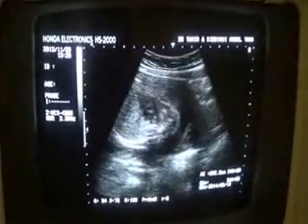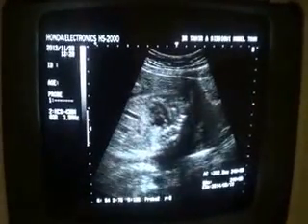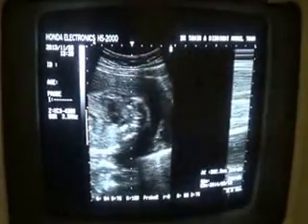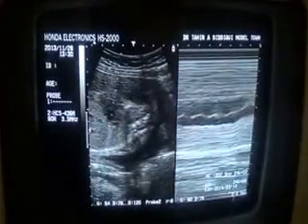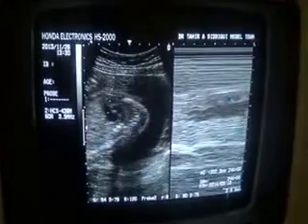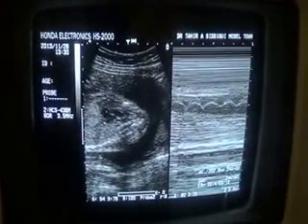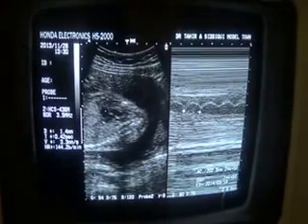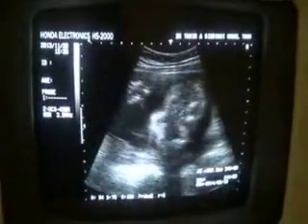I call this fetus number one because the one that is close to the os is labeled as twin number one. You can see the cardiac activity of twin number one. The cardiac activity is approximately 144 to 145 beats per minute with a regular waveform. Fetus number one has a transverse lie.